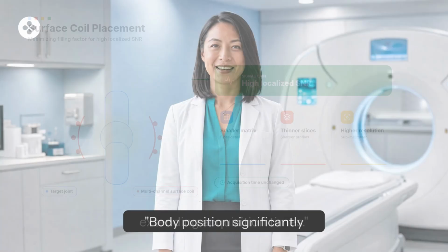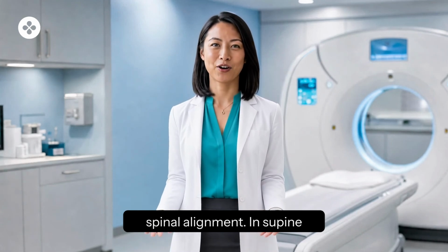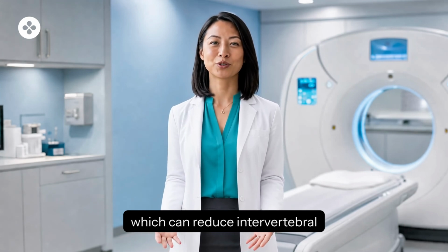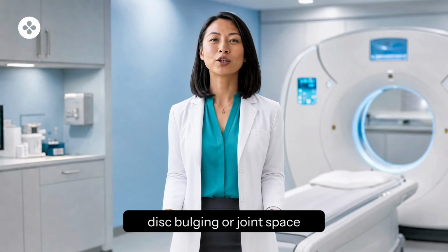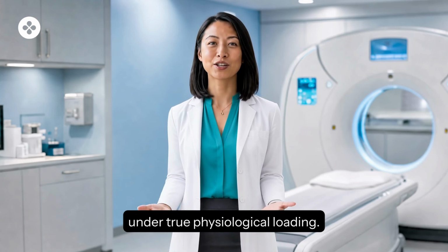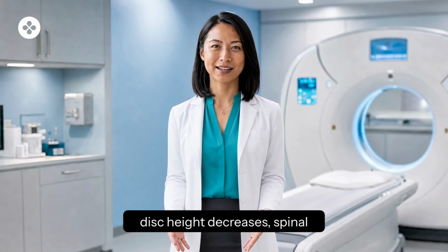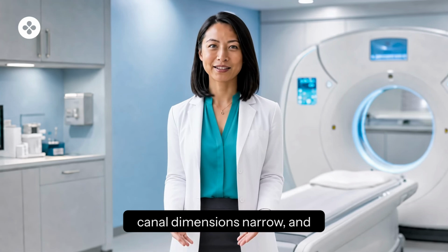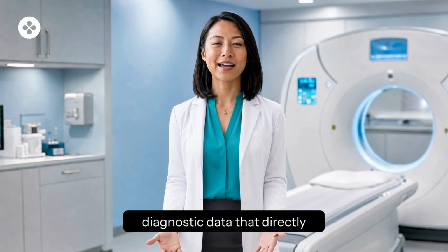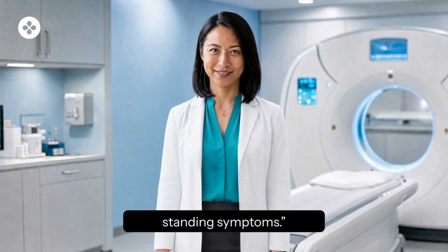Body position significantly impacts joint kinematics and spinal alignment. In supine imaging, gravity is eliminated, which can reduce intervertebral disc bulging or joint space narrowing. Weight-bearing tilt MRI systems allow scanning under true physiological loading. Under axial load, intervertebral disc height decreases, spinal canal dimensions narrow, and meniscal displacements become more pronounced, providing diagnostic data that directly correlates with the patient's standing symptoms.